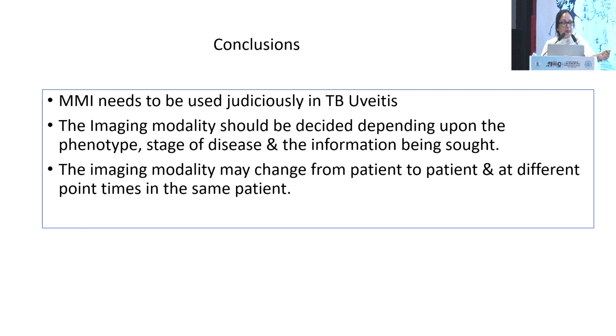For example, at baseline, you may want to do ICG because you want to see the extent of the disease. But while you are following up the patient, you can follow up the same patient on autofluorescence. And subsequently, when there is cystoid macular edema, you do OCT. And many years later, when there is new vascularization, you look at it and decide what you want to do now. So that's all for today.